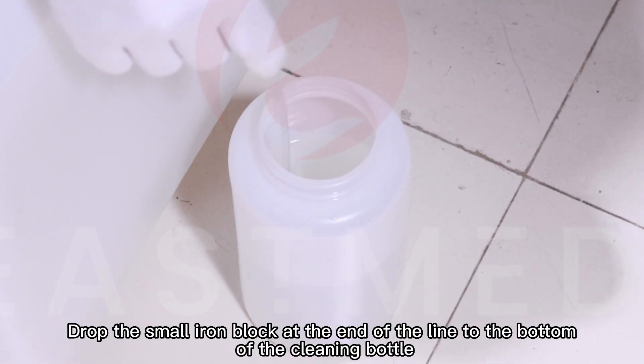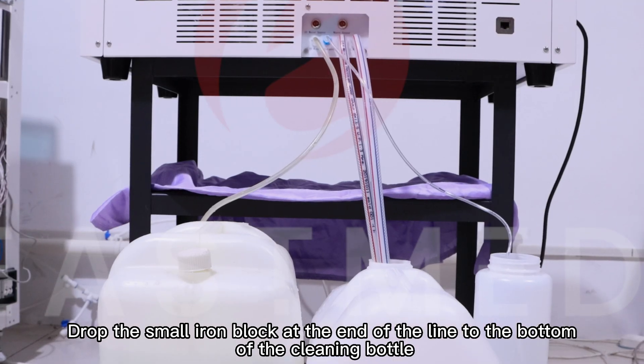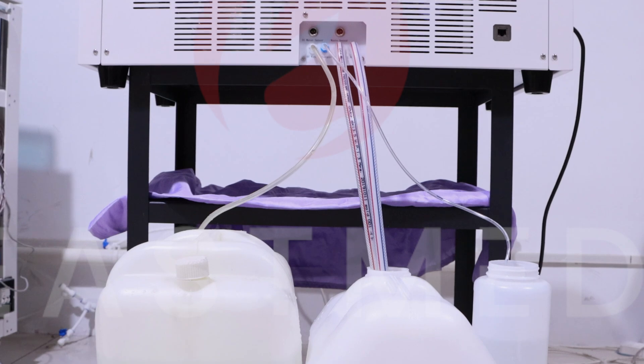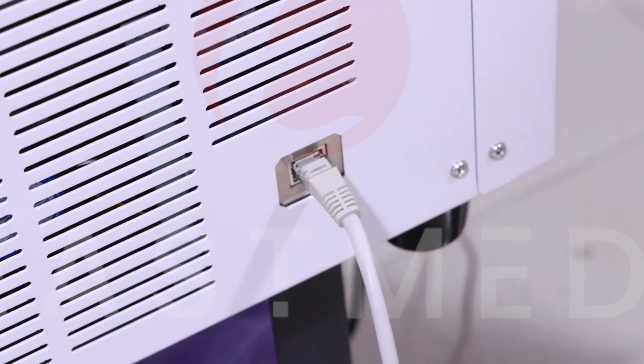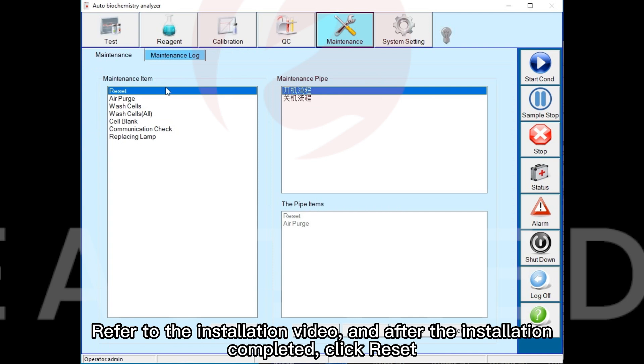Drop the small iron block at the end of the line to the bottom of the cleaning bottle. Plug in the network cable. Refer to the installation video, and after installation is completed, click reset.